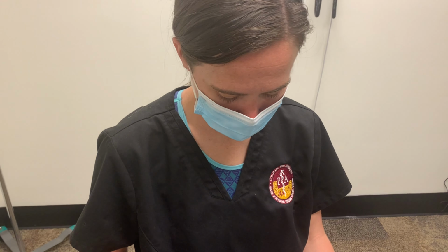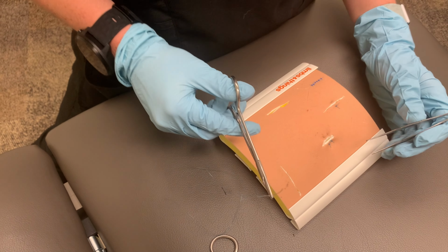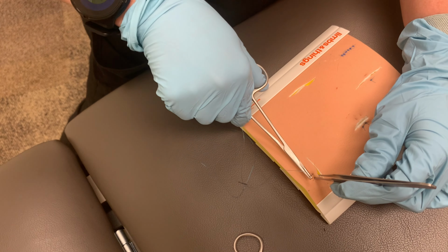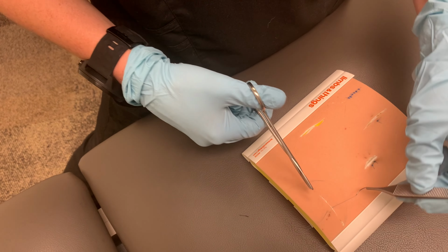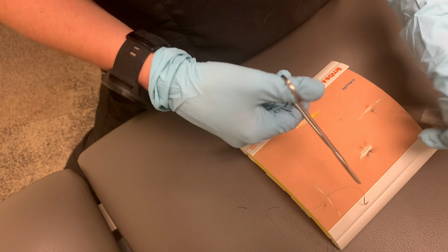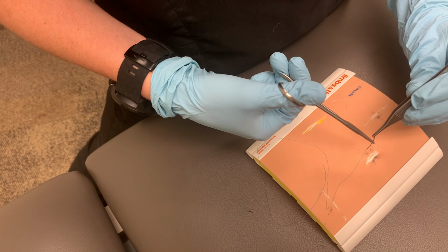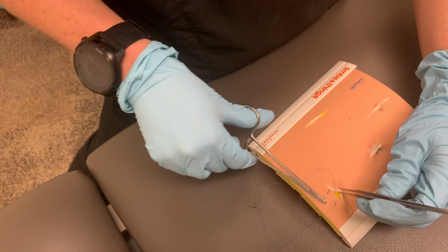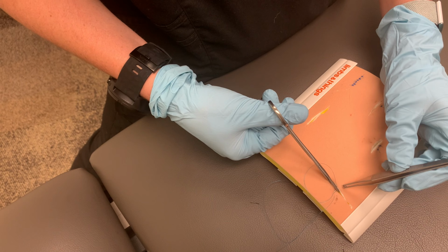Okay, Alicia will now demonstrate the interrupted suture technique. She's holding the needle with the needle driver approximately two-thirds of the way across the needle. She's going to grab the skin with her Adson forceps and enter at a 90-degree angle, turning her hand like she's turning a doorknob to bring the needle through the skin, and then she will re-grab the needle, hold the skin with the forceps, and again enter at a 90-degree angle, driving the needle through the skin.